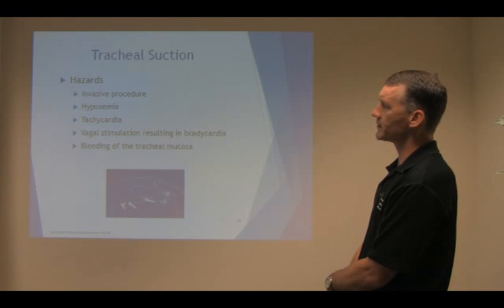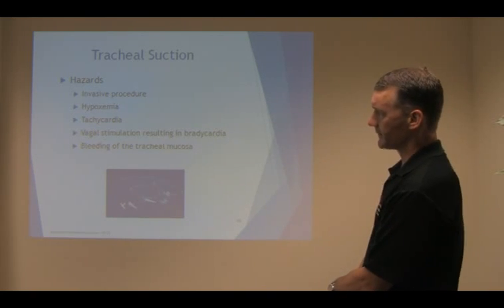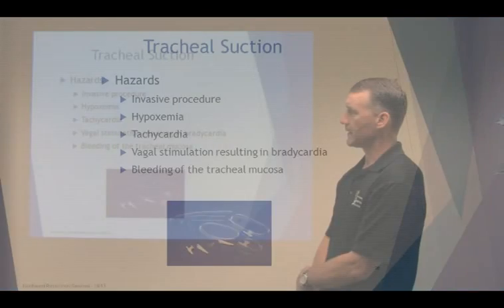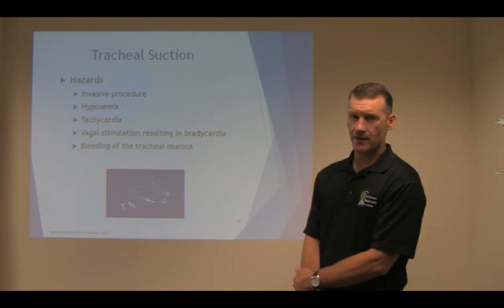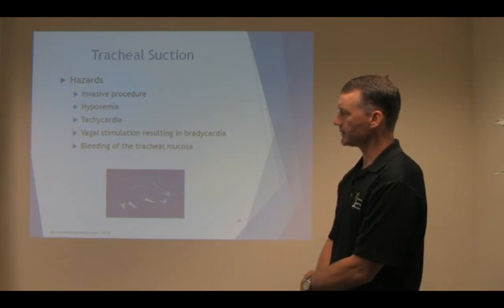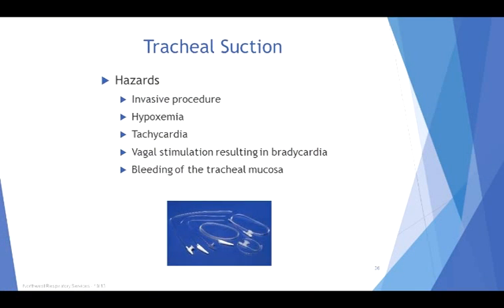Some hazards of tracheal suctioning. It is a very invasive procedure, and it has to be done correctly. Hypoxia. If we think about it, we're literally sucking all the oxygen out of our patient's lungs. Tachycardia. It can be an extreme event for the patient being suctioned if not done right, which can elevate their heart rate. Vagal stimulation, resulting in bradycardia, bleeding of the tracheal mucosa.